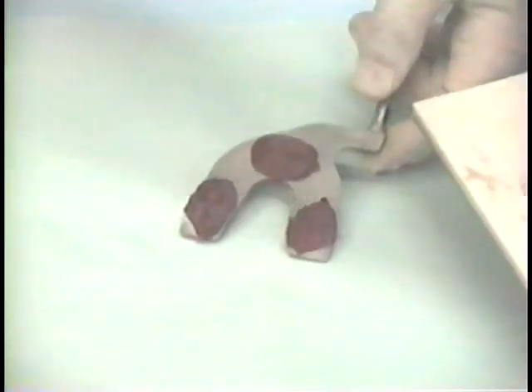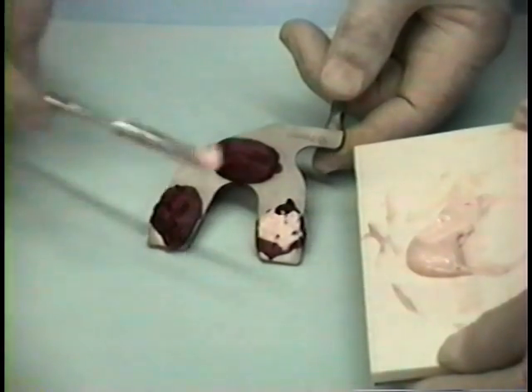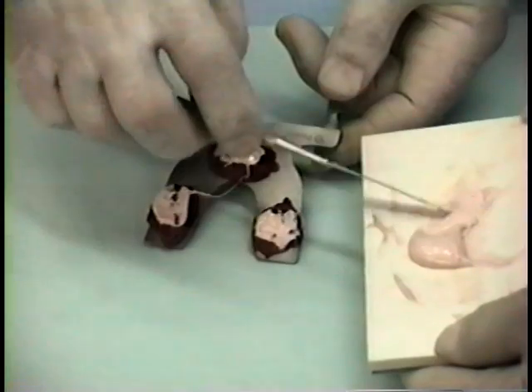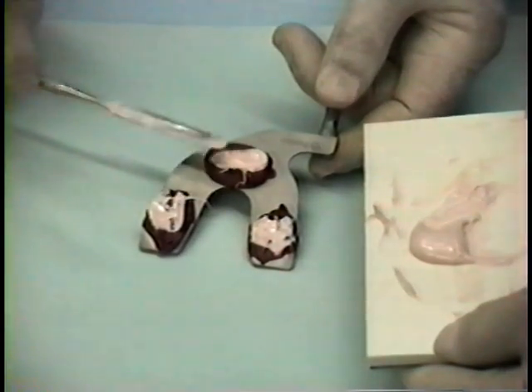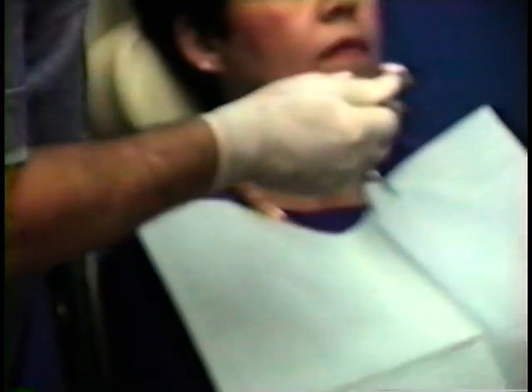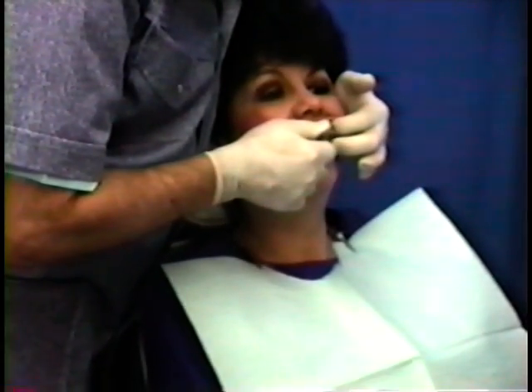Next, place a small amount of zinc oxide eugenol bite registration paste on the three compound pads of the maxillary side only. Include distal extension edentulous areas. Reposition bite fork in patient's mouth and have patient close teeth to support fork until paste hardens.